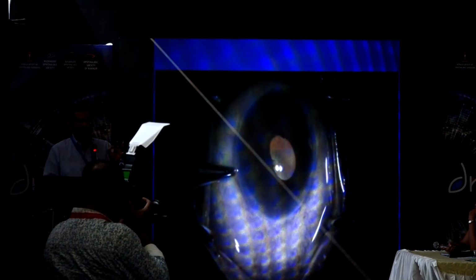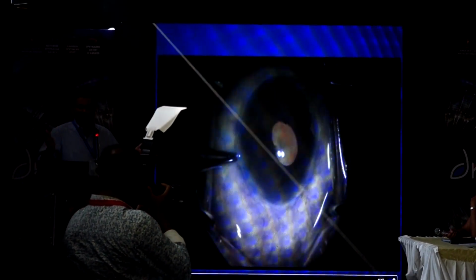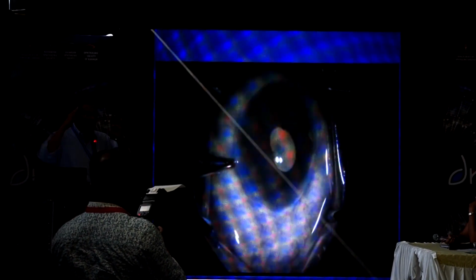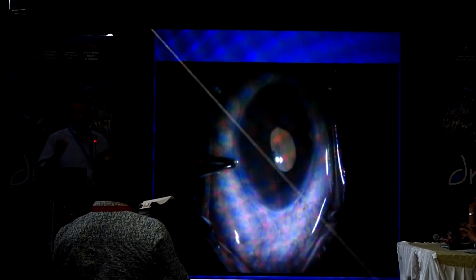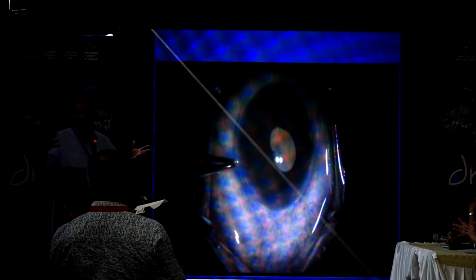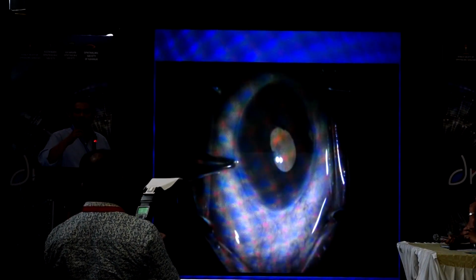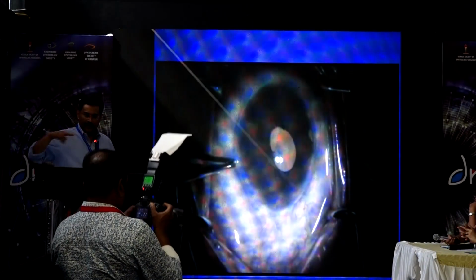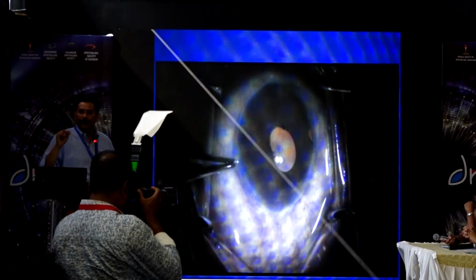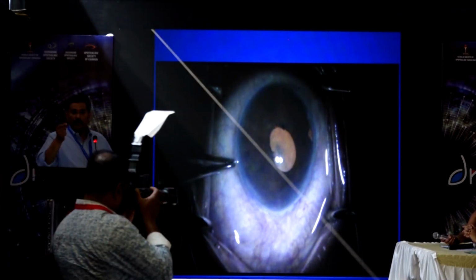It is actually very small, and they need not be hydrated. They are not multiple paracenteses. They do not induce astigmatism. Please let go of all these myths that if you put incisions for hooks, it will induce astigmatism, or there will be more openings. These are very, very minute openings. Only thing is, you should not be going into the cornea to make them. It should be parallel to the iris, a stab entry, and the smallest possible. Try to see what is the smallest possible for the hooks which you have.